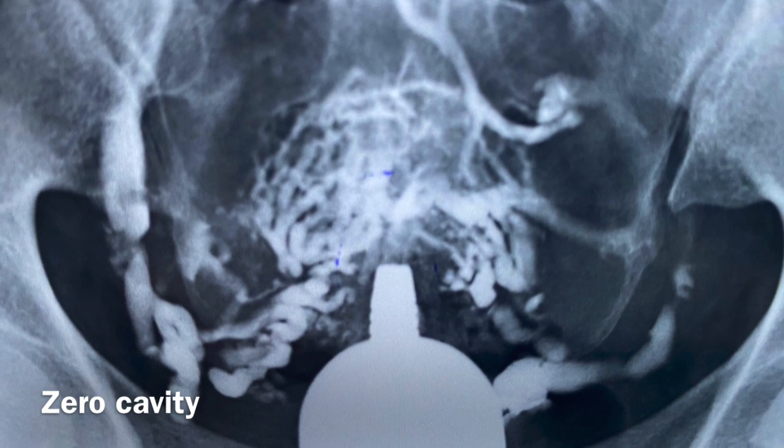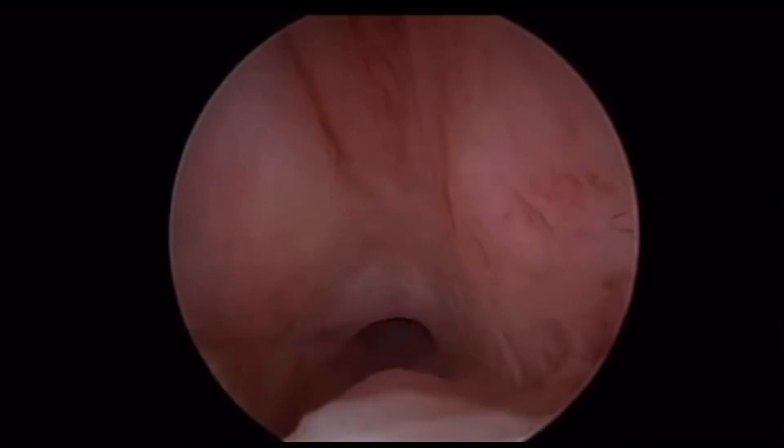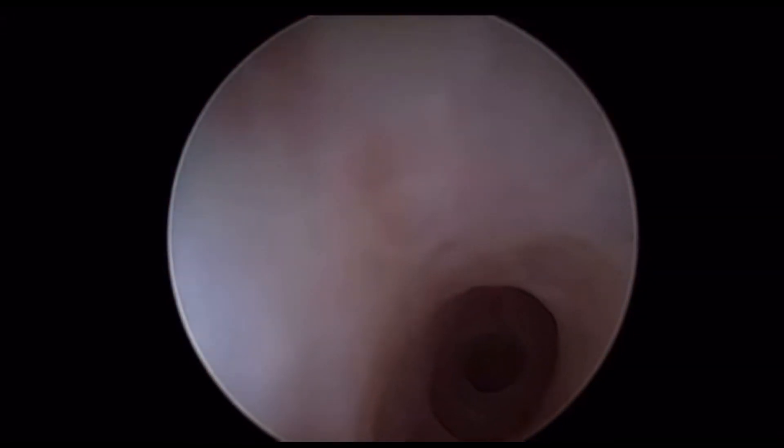No doubt that intrauterine adhesions — Asherman's syndrome — is the most challenging hysteroscopic surgery, especially when there is a complete obliteration of the uterine cavity, with the frustrating hysterography showing zero cavity.